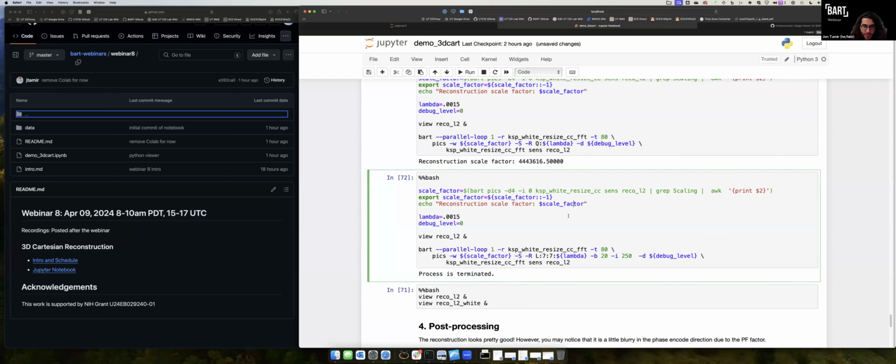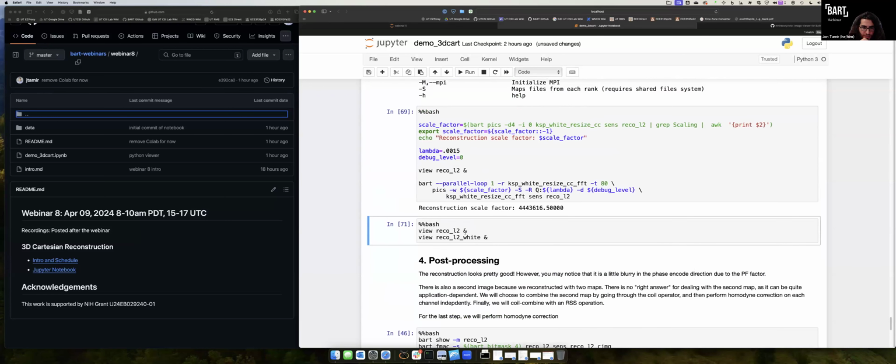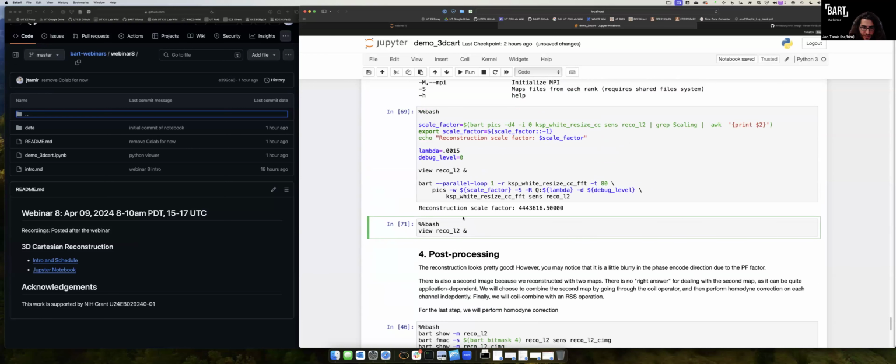Okay. All right. Are there any other questions, or do we want to stop here? So we'll go ahead and share the data so that you can run this on your own. Again, I recommend running it locally because the goal here is to visualize the data as you work with it. And I don't think that that workflow is fully captured with a single notebook.